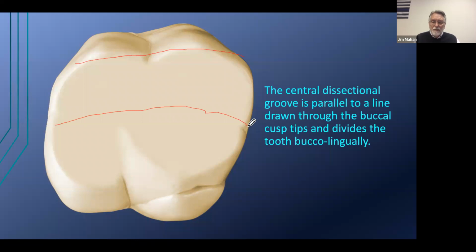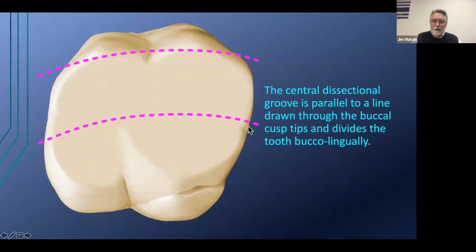What we're doing here in these drawings is creating for you a standard, stable reference. This is not every tooth, but based on the parameters that I'm going to give you, you'll be able to see that by measuring everything, we're going to be able to create a very acceptable looking tooth. Okay, so this would be our diagram that shows you how it looks.